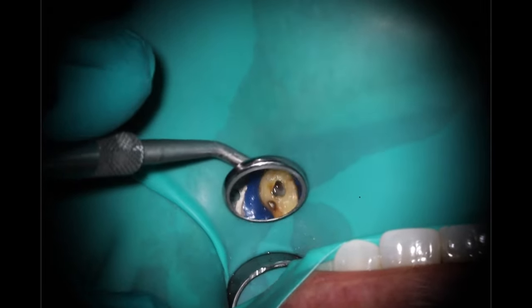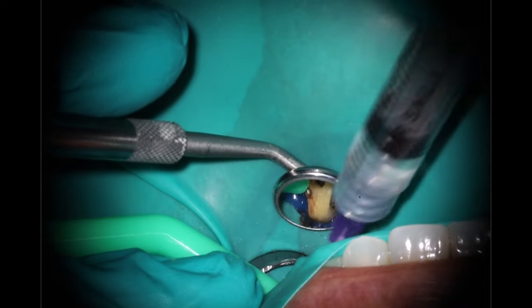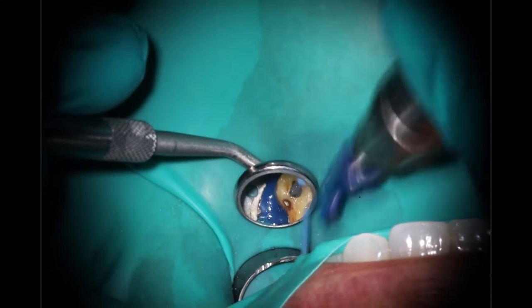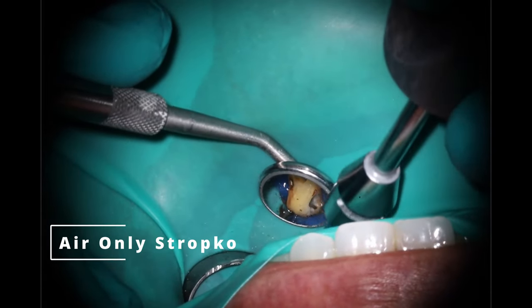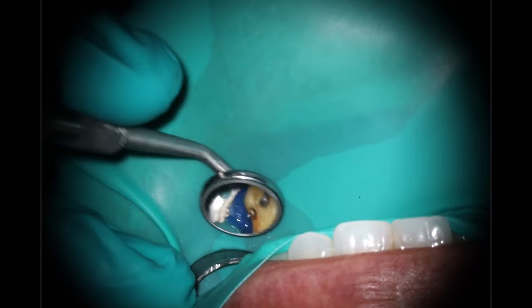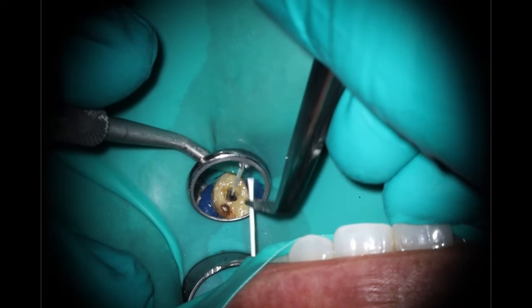You can feel me struggling — how on earth am I going to get that into the palatal canal? I just gave up, it's not going in there. So rinsing out here with the rest of the Triton just to remove any debris I created inside there, and then we're going to get ready to fill up this case. Using my little micro suction here on my ASI cart to remove as much of the liquid as possible, as well as from that palatal tissue. Even though it was in the sinus, we didn't get much drainage looking at that cone beam — she really doesn't have a lot of mucositis or any issues inside the actual cone beam.